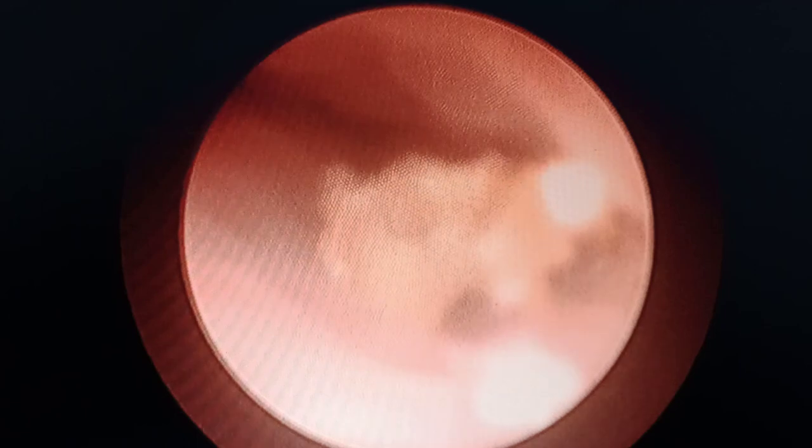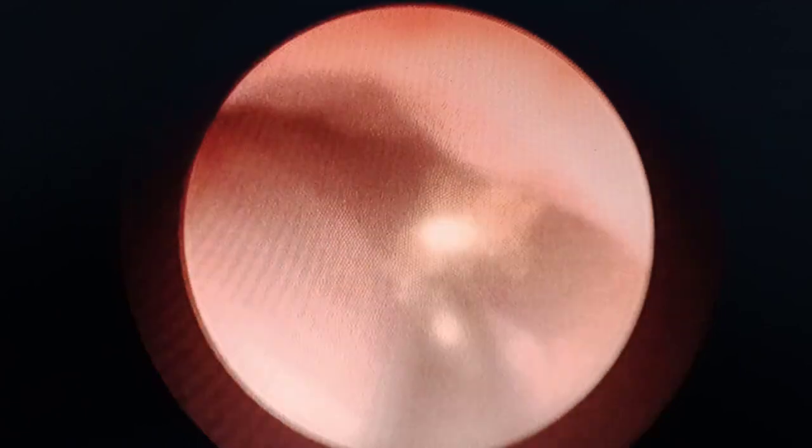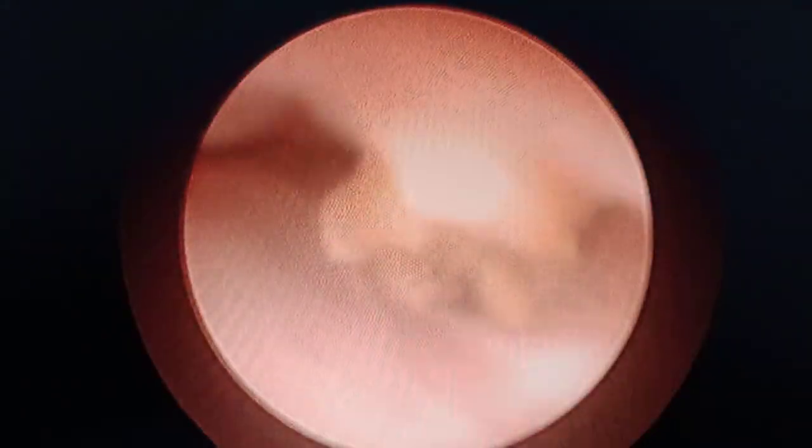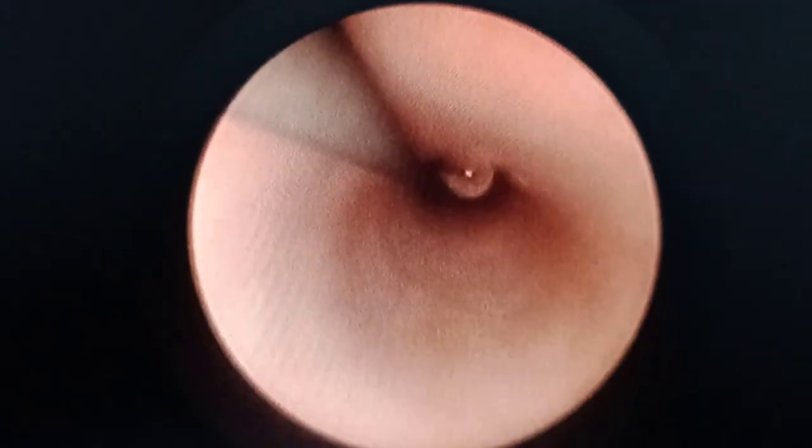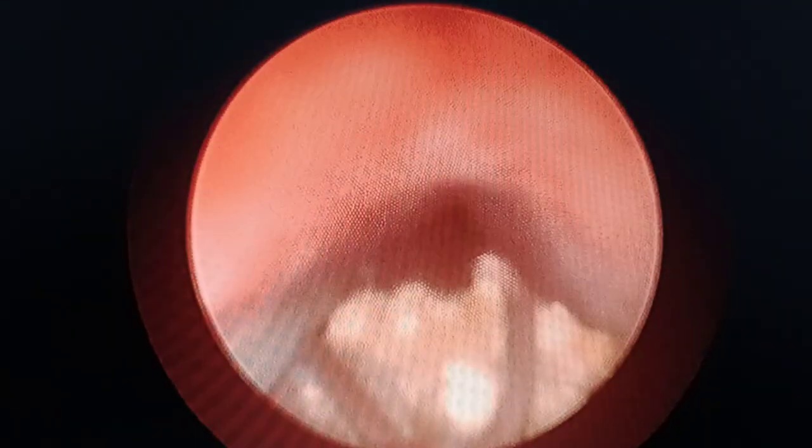Believe yourself, believe your capabilities — you can always do it — but in confusion seniors are always there to help. At the proper time you can always ask for help. Now here you can see we have almost cleared the lumen. The guide wire is there — just recheck the clearance and remove any stone fragments with the help of the tri-prong.